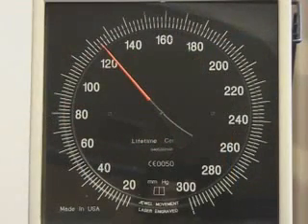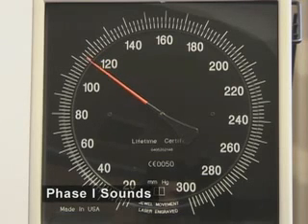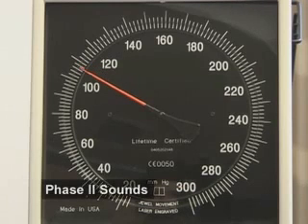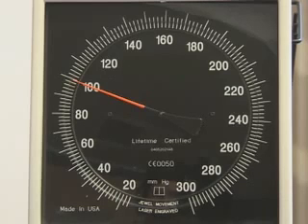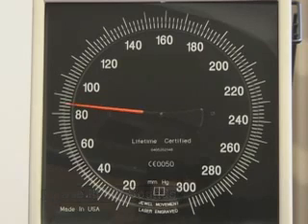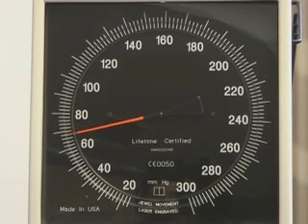Phase 1 sounds are clear, repetitive tapping sounds that coincide with reappearance of a palpable radial or brachial pulse. The onset of phase 1 sounds is equivalent to the systolic blood pressure. Phase 2 sounds are audible murmurs in the tapping sounds. Phase 3 and 4 sounds are muted changes in the tapping sounds that occur as the pressure measurement approaches the diastolic pressure, usually within 10 mmHg of true diastolic pressure. Phase 5 sound is not really a sound, but rather is the level at which sounds disappear, and it indicates the diastolic blood pressure.